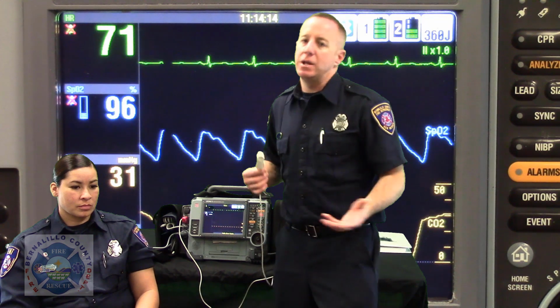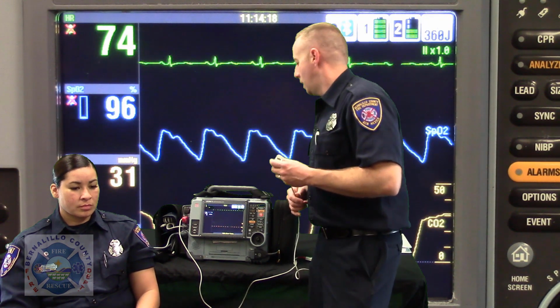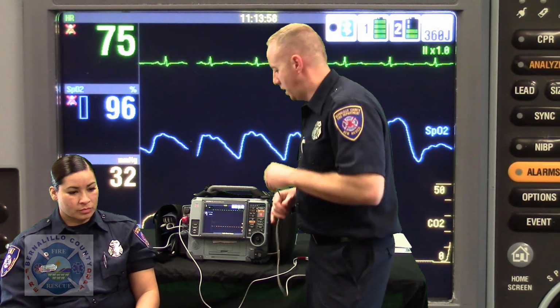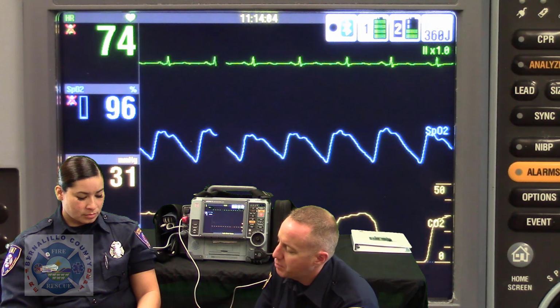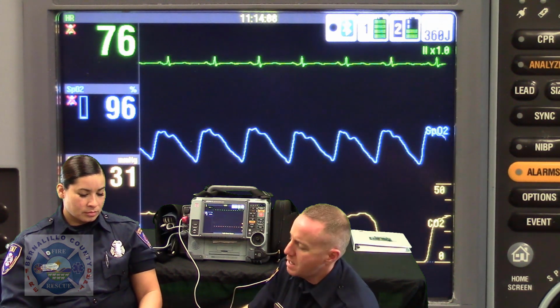You and I using a manual blood pressure cuff, again, that's a non-invasive blood pressure monitor, or non-invasive blood pressure technique. So that's what the NIBP stands for, if you didn't know. Little factoid. So I have my patient here. I'm going to come down, I'm going to assess her. I see she has good skin color, good cap refill, her fingers are warm. I'm going to use the ring finger of her non-dominant hand.